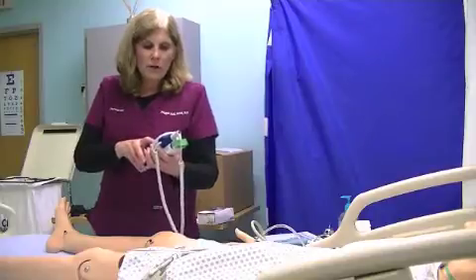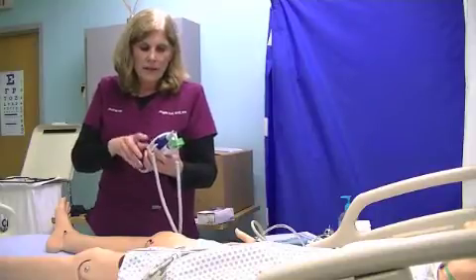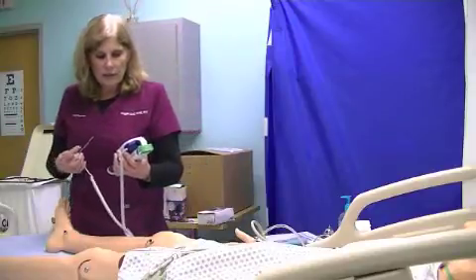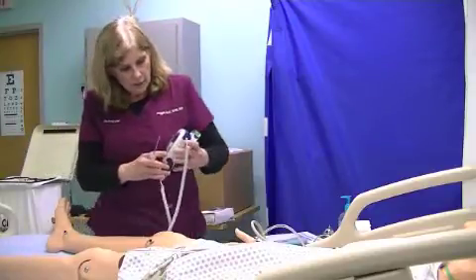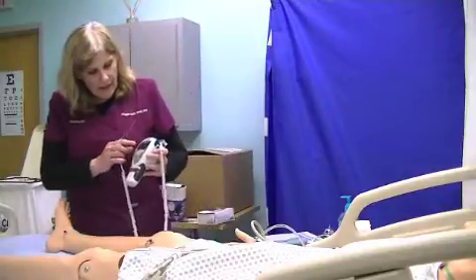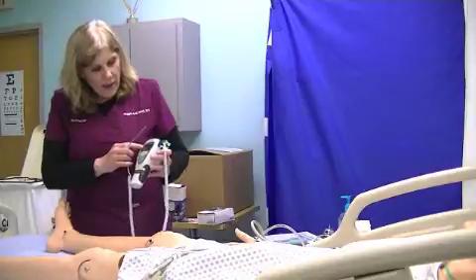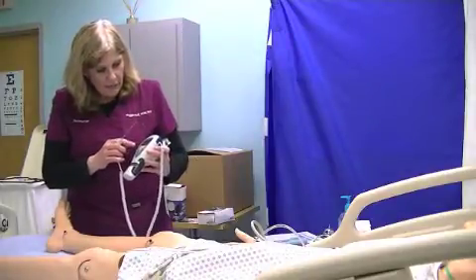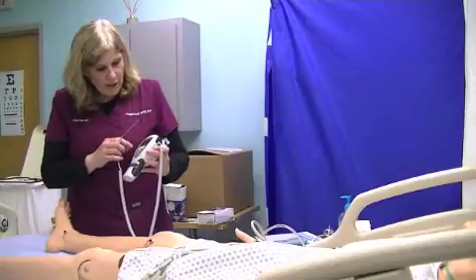When we take this off, we want to make sure that we look here, and it has a picture of a little man with it flashing. If the head is flashing on this side, that means we can do the oral temperature. If we push it again and the body is flashing, it means axillary.